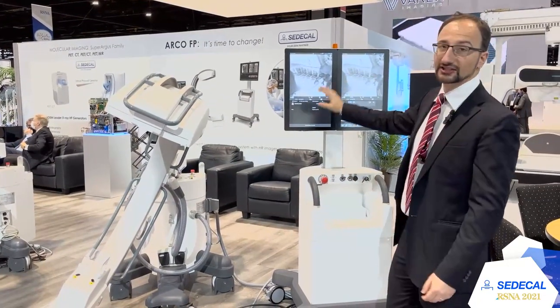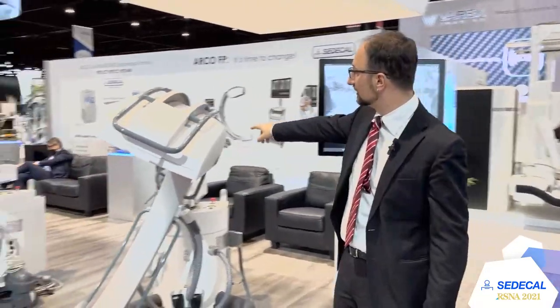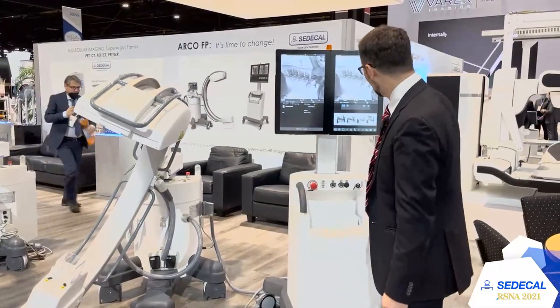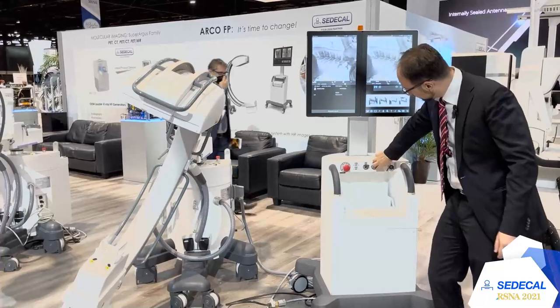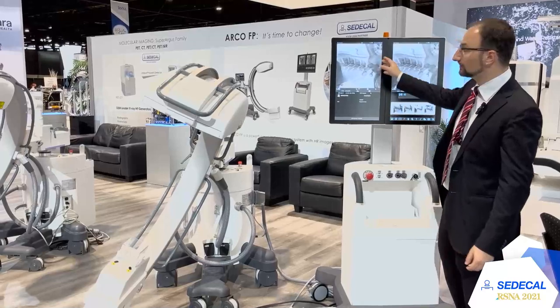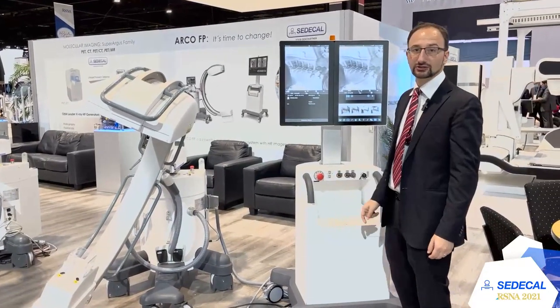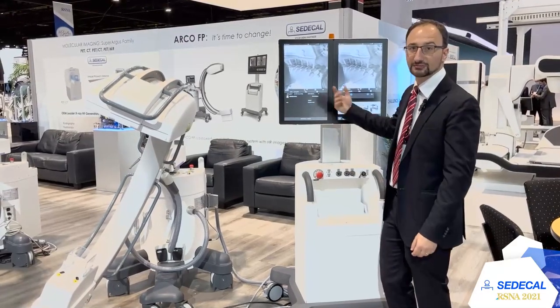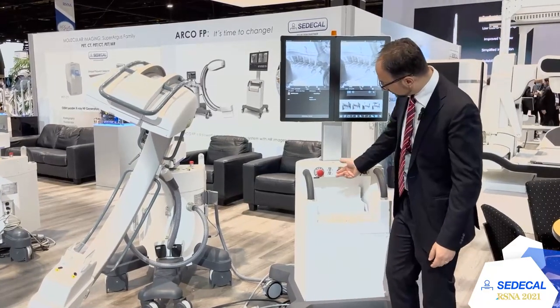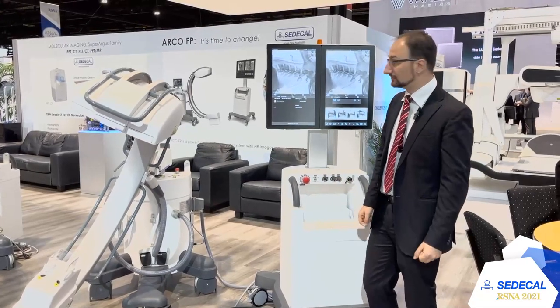The system is completely touchscreen. We have two big screens on the trolley monitor and an additional control panel where the operator can see the image during surgery. We also have two HDMI outputs for an external monitor, USB connection to export examinations, a CD burner option, and a local printer to print images on film.